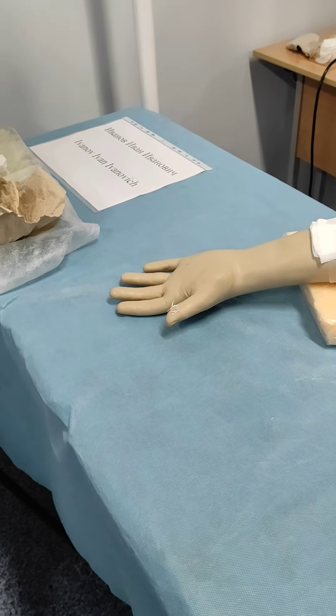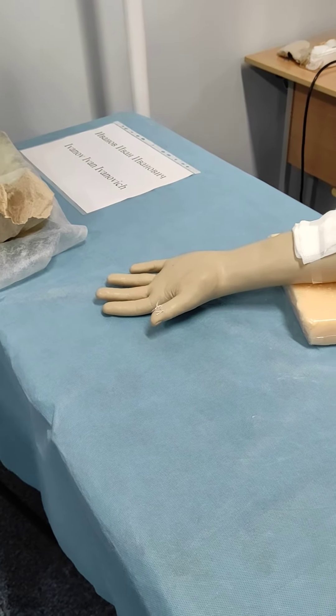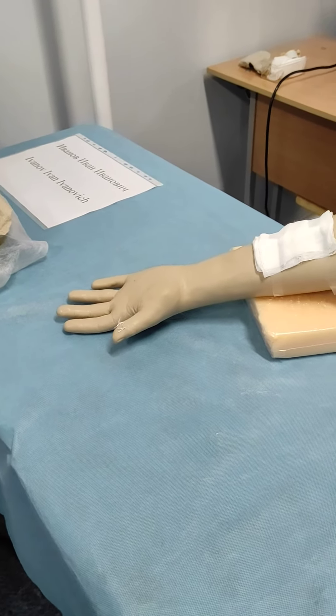Don't forget, apply three layers of the bandage. Which is important. Don't touch.